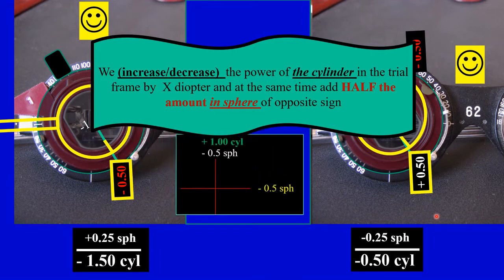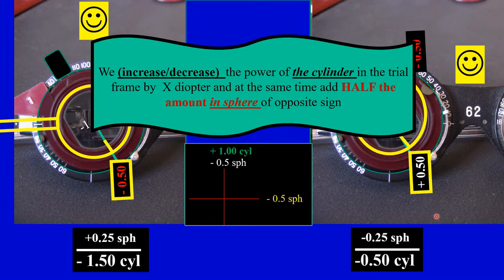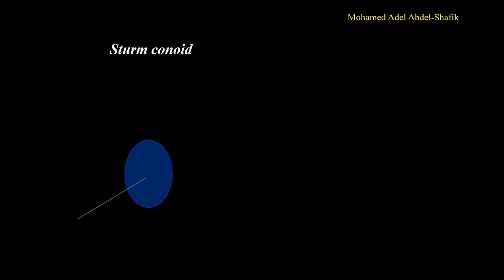Why is that? Because actually the cross cylinder we are using affects both meridia, and it has an effect of plus half and minus half. So we need to change everything. Why will the patient see with one position better than the other?